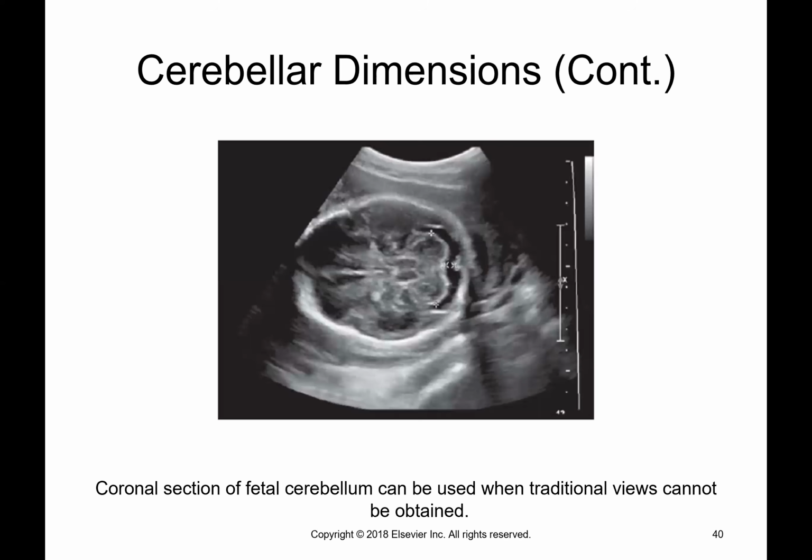So let me show you this. This is the cerebellum here. So you'll measure, it's the peanut looking thing in the brainstem. I kind of love how the cerebellum always looks, especially at 20 weeks. So you'll measure from side to side. Then the back of the cerebellum, you'll measure the cisterna magna from the vermis to the occipital bone. And that's it with that.